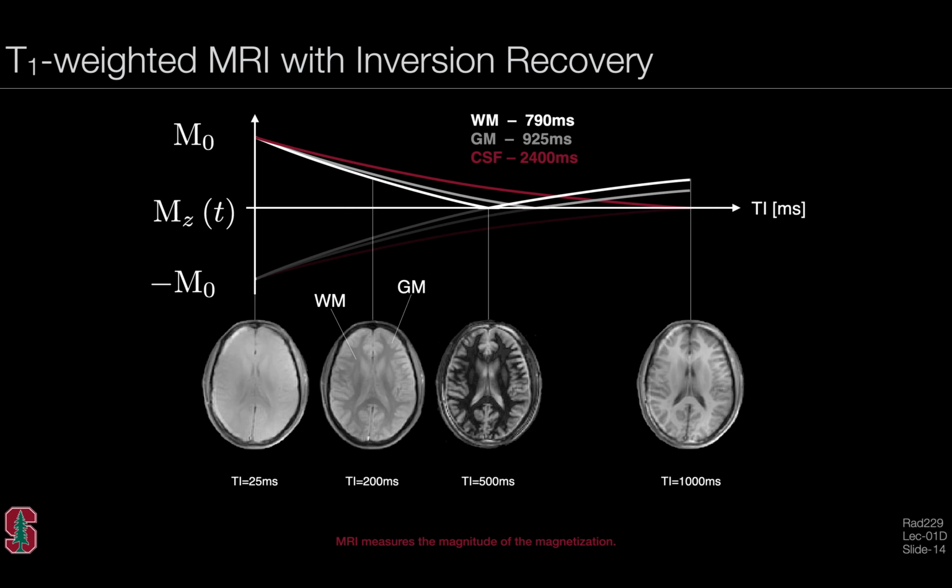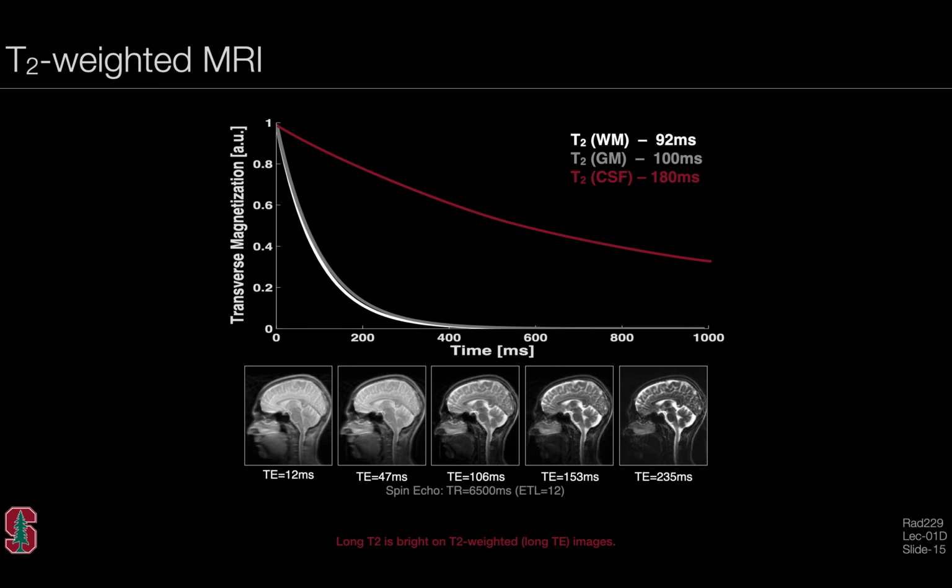And if we wait until a much later time, as shown here, then the gray matter signal is actually lower than the white matter signal, and this gives relatively inverted contrast compared to, say, the second image that we were showing before. So again, MR is well regarded for having dramatic soft tissue contrast and the ability to manipulate widely the soft tissue contrast as a function of RF pulse timing, as a simple example.